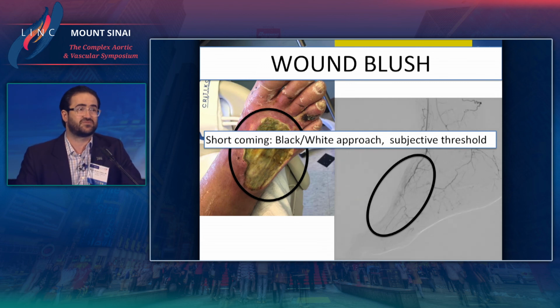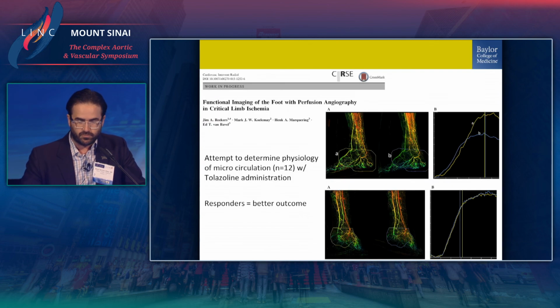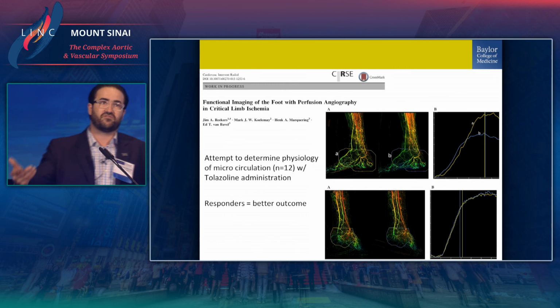It's very subjective to threshold. And if you ask me, I've seen a lot of these wounds that have a blush even before the intervention. So it's hard for me to tell what's a good wound blush positive versus a bad wound blush negative.